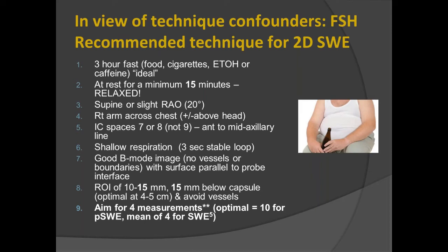So after a lot of experimentation and looking at a lot of these factors, we found that these were really our top priorities for gaining a good 2D shear wave. We asked if the patient could abstain from alcohol or food.